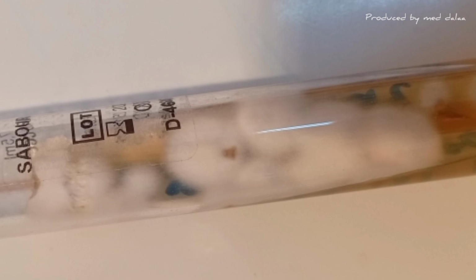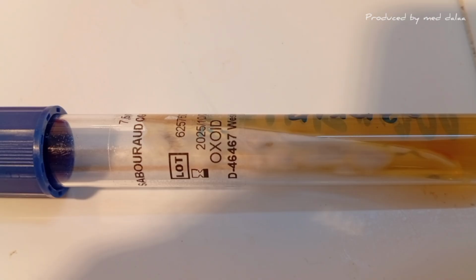The precise identification of the fungal species, dermatophytes, yeasts, or molds, responsible for the infection is then carried out by observing their macroscopic colony appearance and microscopic characteristics on the agar.